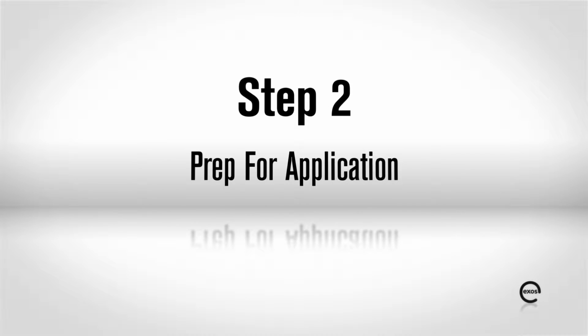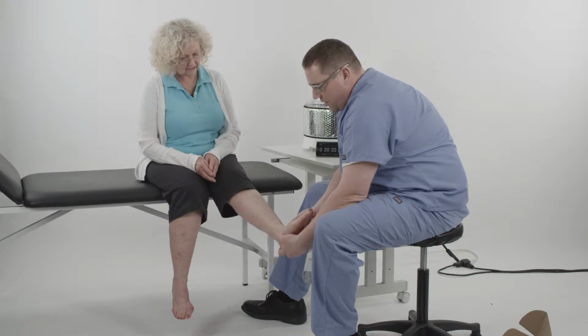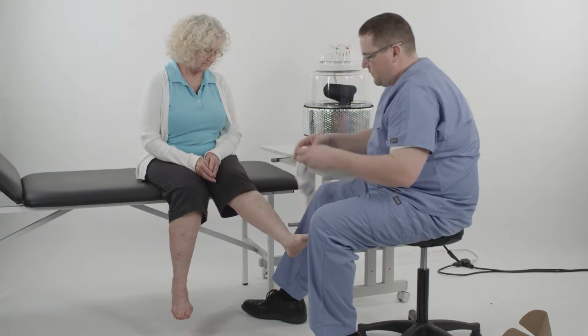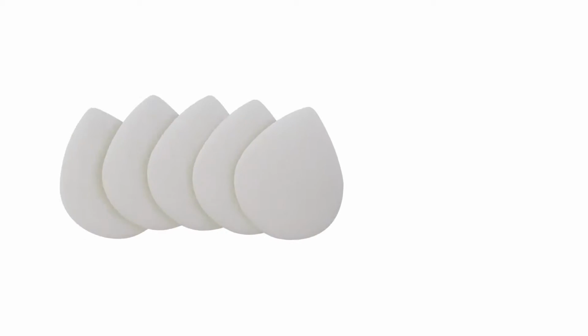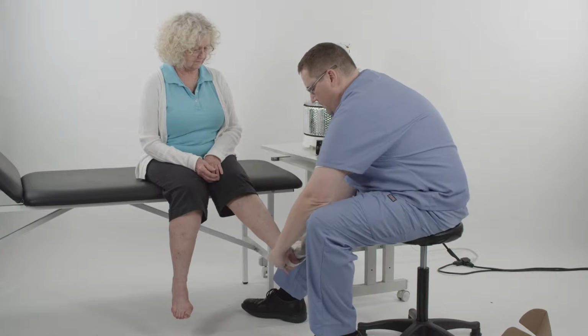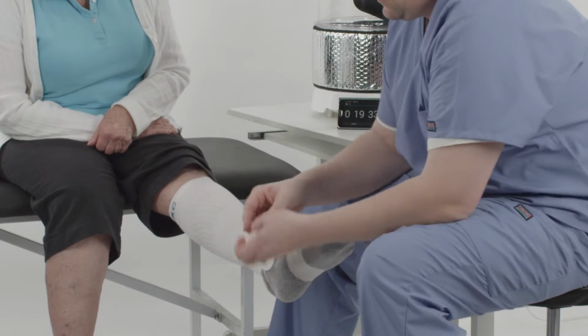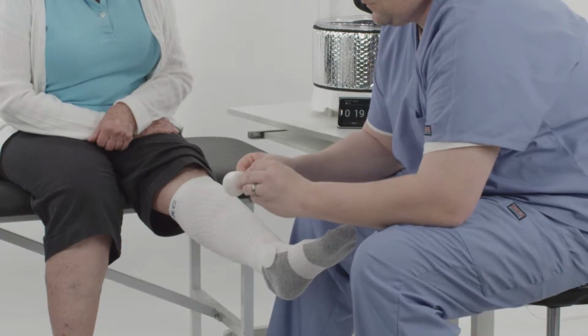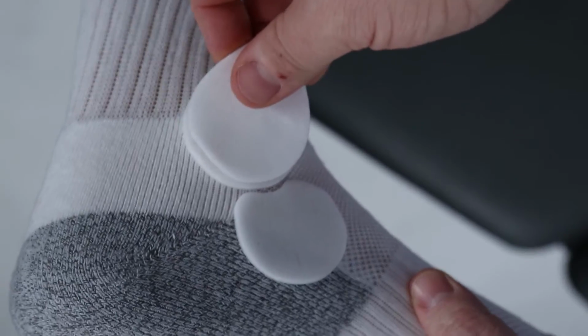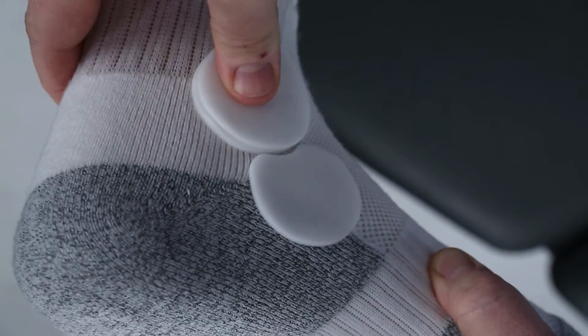While the patient is seated on the exam table or chair, evaluate ankle and foot to identify bony prominences that may require relief pads. Now, place the sock on the patient's foot. Apply the ankle relief to apexes of the medial and lateral malleoli and other bony prominences to ensure proper fit of the brace during molding.